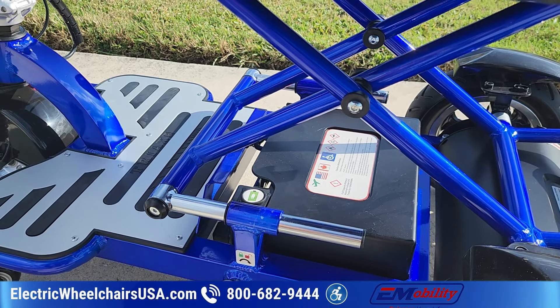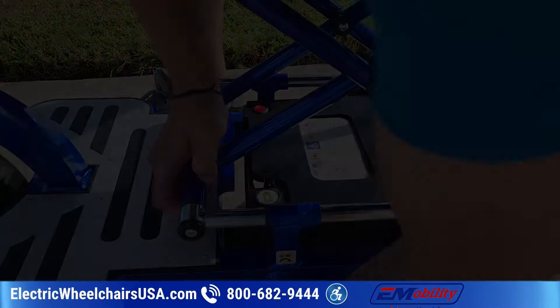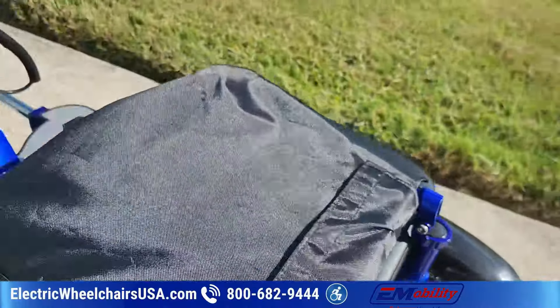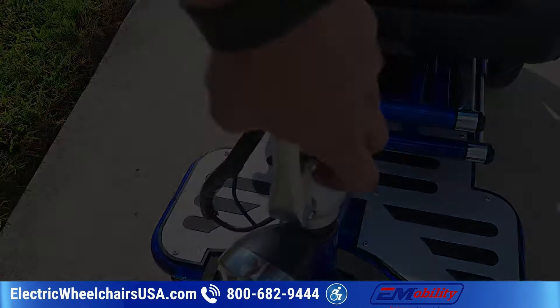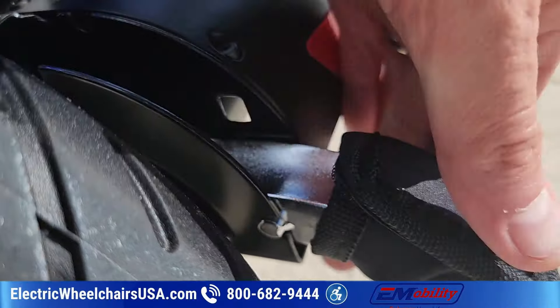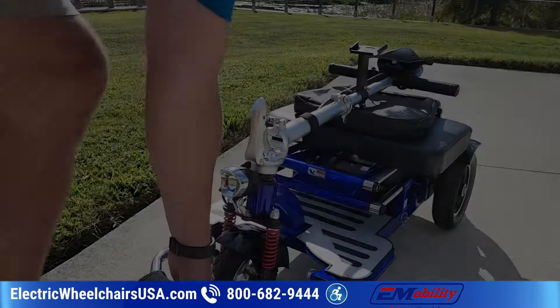To remove the battery, first unplug the power source. On the back of the scooter, pull this little lever and drop the seat down so it lays flat on the floorboard. Remove the key, press the little red lever to pull out the front basket, then fold down the tiller by pulling this little knob so it folds forward and lays flat. Make sure the anti-tip wheels are flipped out — there's a bolt you pull out to do that. With the anti-tip wheels sticking out behind, you can wheel it behind you.